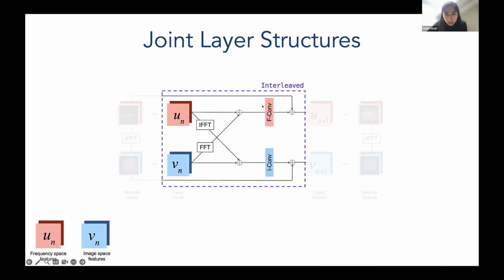And I see there's a question in the Q&A. Okay, so the question says, how is occlusion by other vessel or body parts handled? I think this is for the visualization. So here we're visualizing 2D slices within a 3D volume. So in practice, there's no occlusion here. You would be able to see the other structures if you looked at other slices within the same volume.